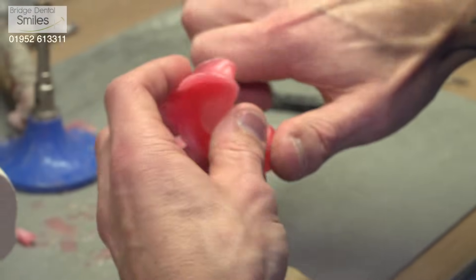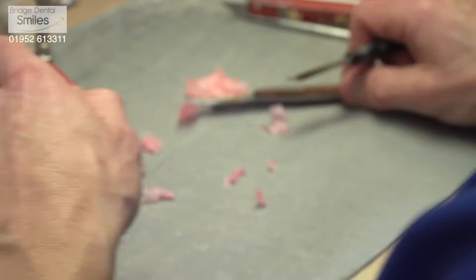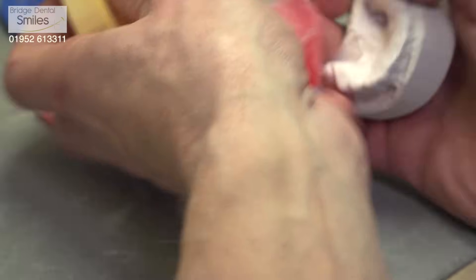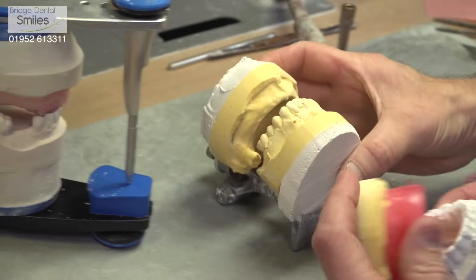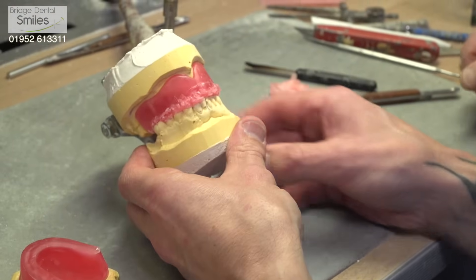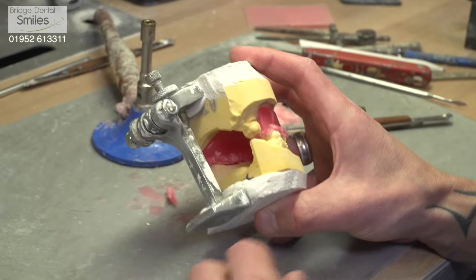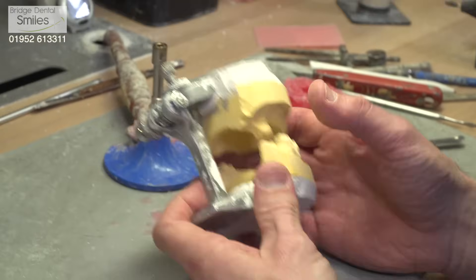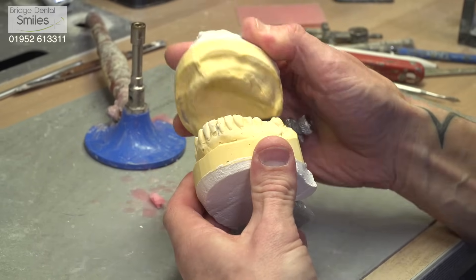This is the wax block — the bite block or occlusal registration rim that the dentist receives from us. The height of it enables him to register the upper jaw against the lower jaw in the correct height relationship. You can see from the articulator over here — that's one that's been used in the mouth — and then we can put the actual acrylic teeth on there to produce the next stage, which is the wax try-in. The basic articulator is what we call a simple hinge: it's a simple open and closing arrangement in one direction, and produces a basic centric relationship — just a jaw opening and closing relationship.